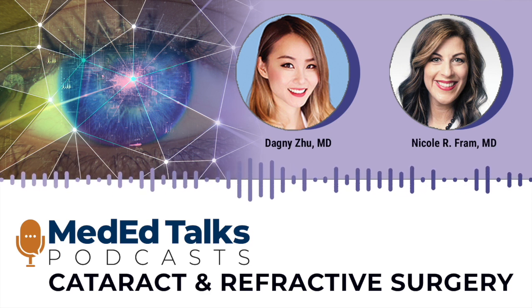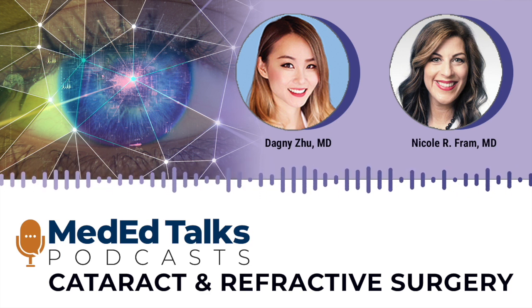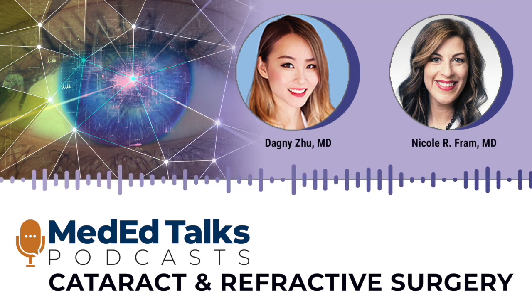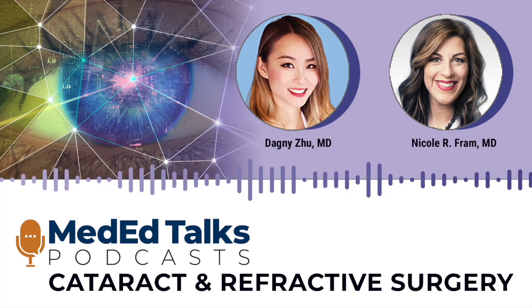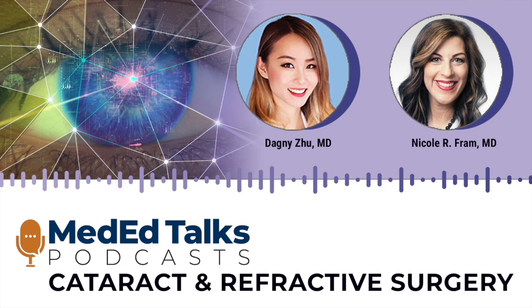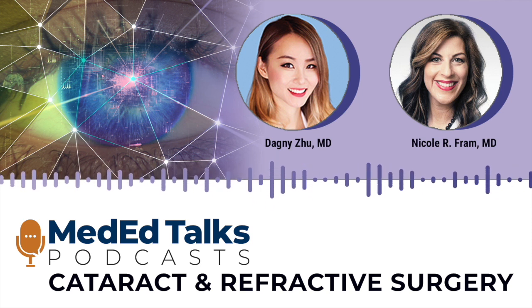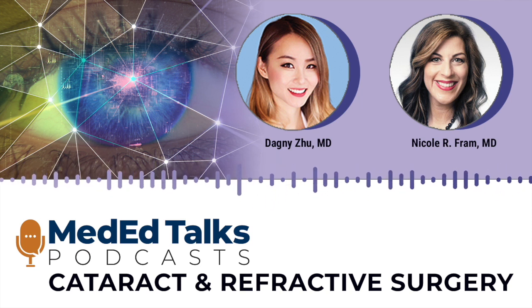I would say the only other way that I use it, maybe for cataract surgery, is to identify those patients with really subclinical EBMD. Sometimes I'll miss it on slit lamp exam, but their epithelial map will just look totally warped, with areas of thinning and thickening, and often those are patients who would benefit from superficial keratectomy before surgery. So that's another way that I use it.